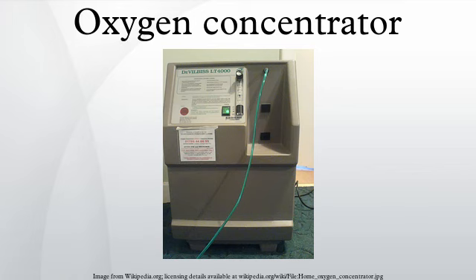Unlike in commercial airlines, users of aircraft without cabin pressurization need oxygen concentrators which are able to deliver enough flow rate even at high altitudes, such as Oxyfly. Usually, demand, or pulse flow, oxygen concentrators are not used by patients while they sleep. There have been problems with the oxygen concentrators not being able to detect when the sleeping patient is inhaling.